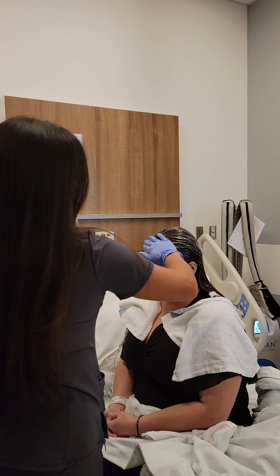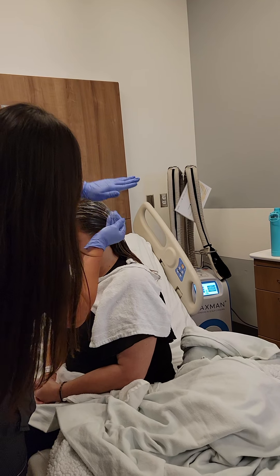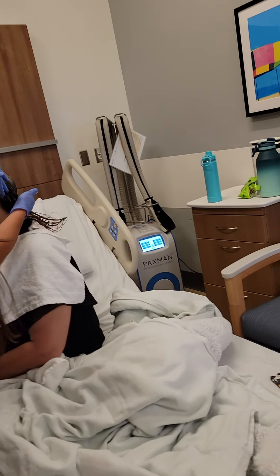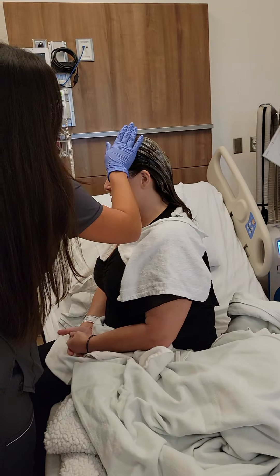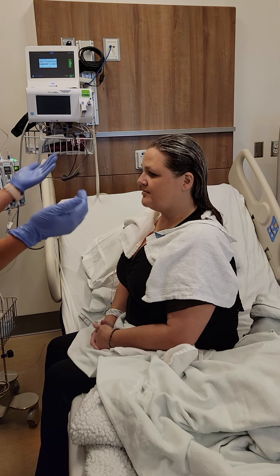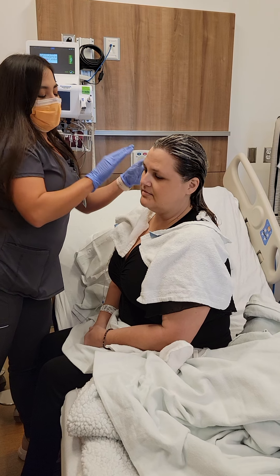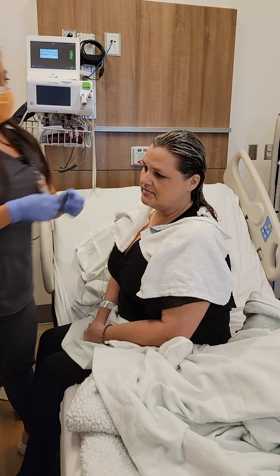So you put it on top and then go into the back right here where the blue cap is going to be, so it won't pull the hair. The other day they took the cap off and a bunch of the hair came with it. That's why you want to put on a good amount of conditioner so it can just slide off. Also, you have to thaw your hair afterwards — you don't just remove it. That feels good though.